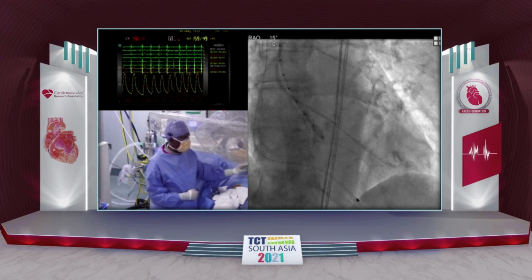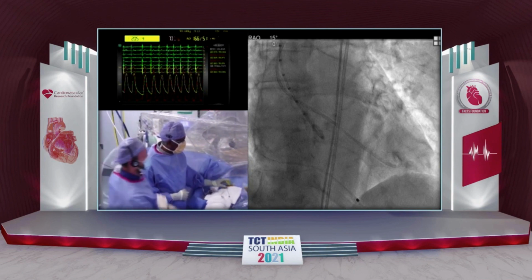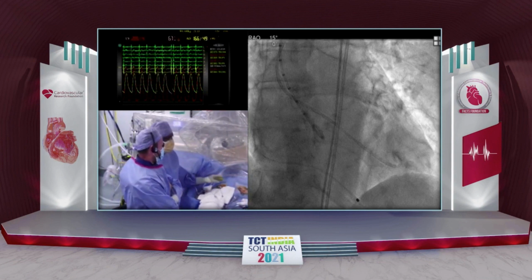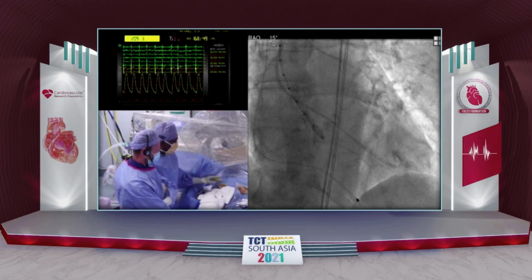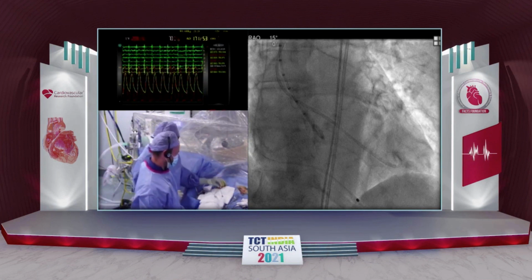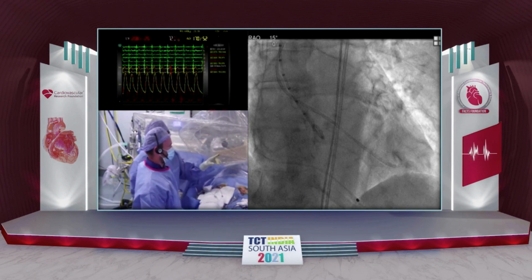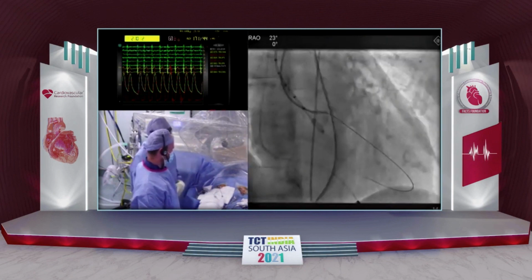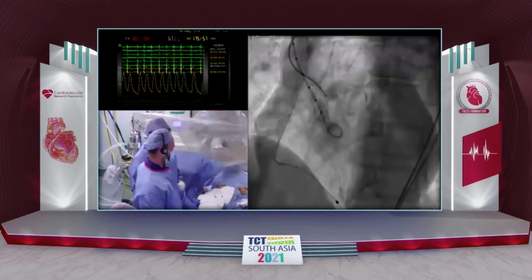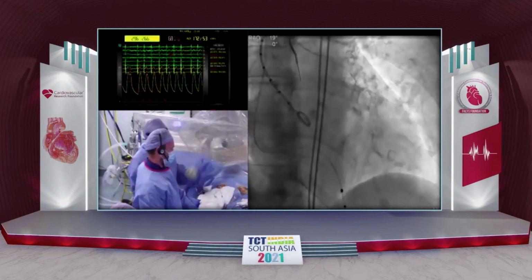I've gone down the left femoral access for the 6 French sheath, and then I put the large bore sheath through the right femoral artery. For pre-closure, I put 1 ProGlide and 1 ProStar device, giving you 3 sutures to obtain hemostasis after TAVI. There's a 16 French sheath already in, we have crossed the valve. Maybe, David, if you can show the playback of the crossing and the positioning of the back again. Sorry, forward one.